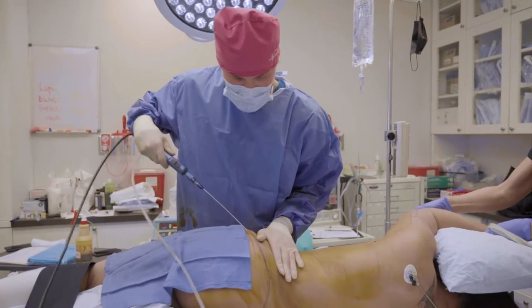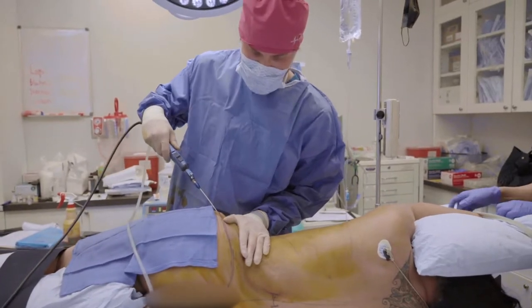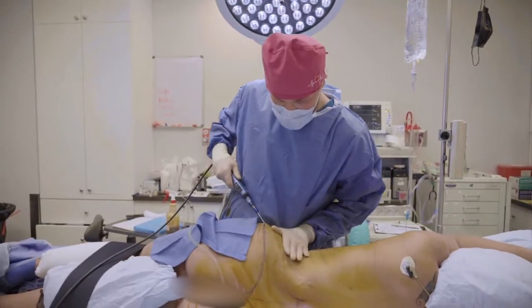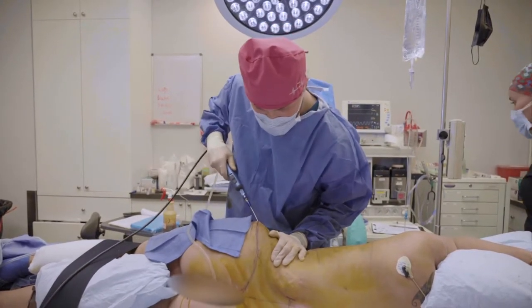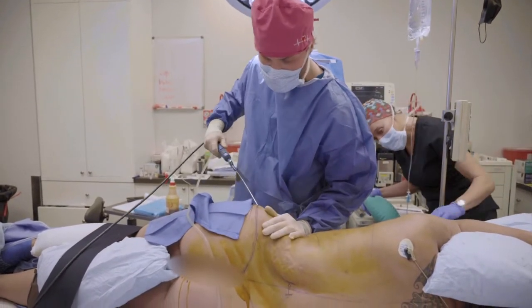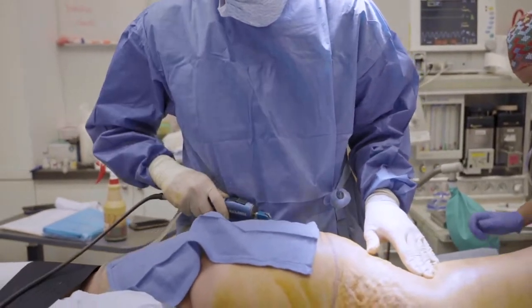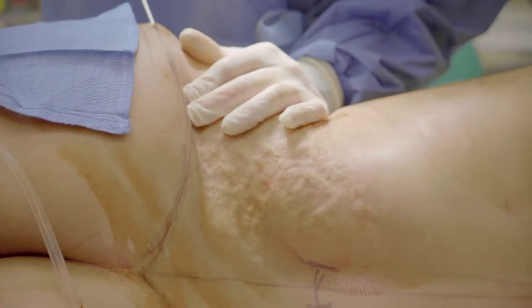Here's the right side. This is the anesthesia — first step is always the anesthesia. Trying to make your waist a little bit narrower, or a lot narrower — we'll see how it comes out. I'm just numbing everything up as much as I can until everything is numb.